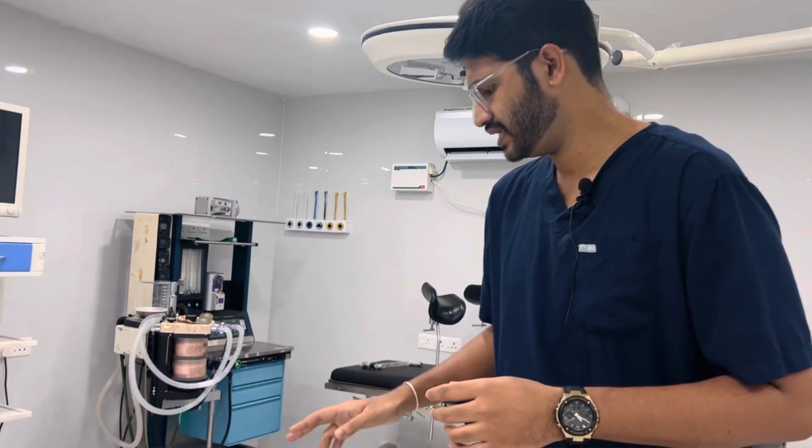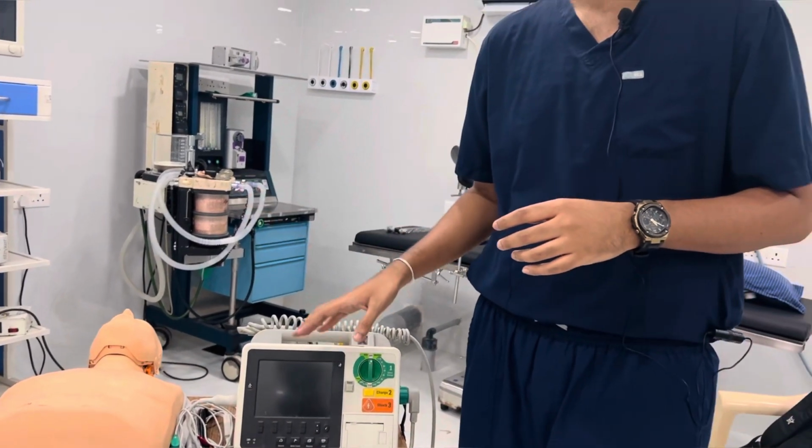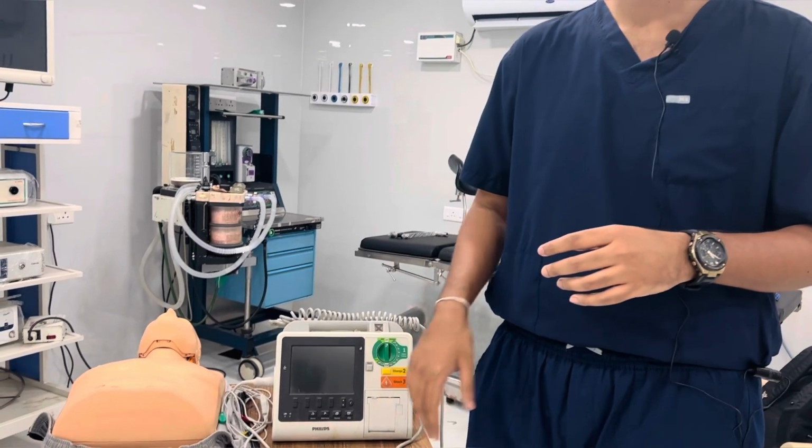What energy can be used in defibrillation for a shockable rhythm? Use the maximum energy, maximum joules. In every ER and ICU, you will have a defibrillator. So go to the maximum setting of the defibrillator, roughly 200 joules. Whereas if you have a monophasic defibrillator, go to 360 joules, that's the maximum joule setting.